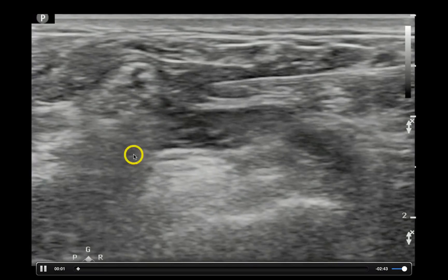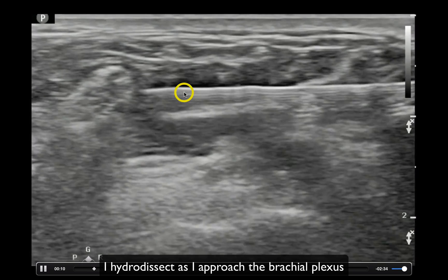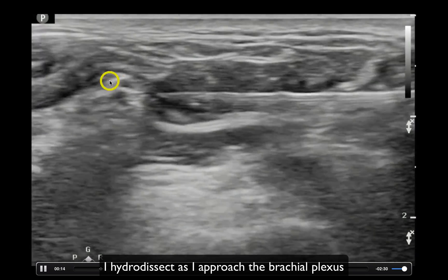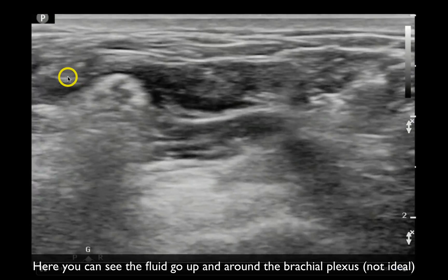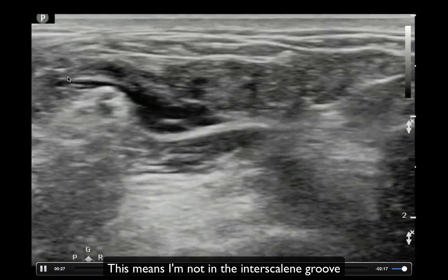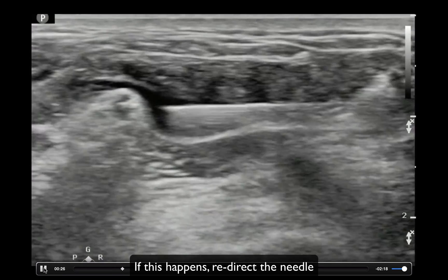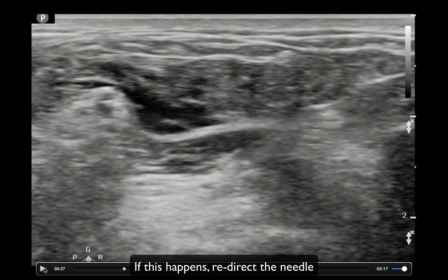Here is another example. We have the brachial plexus over here, the needle shaft, and the needle tip. I'm doing a little hydrodissection as I try to enter the interscalene groove. You can see I'm getting fluid above and around the brachial plexus, which means I'm not quite in the interscalene groove. So I don't like my angle — I'm going to back up to about the subcutaneous tissue and redirect the needle tip more deeply. The reason I don't just force it down is that my needle shaft is already in the muscle belly, so I pull back and redirect without creating a new puncture wound.